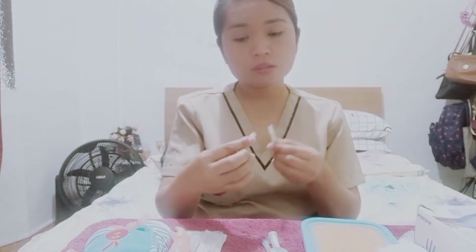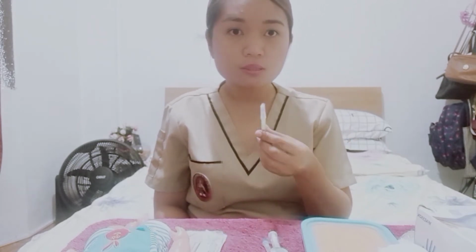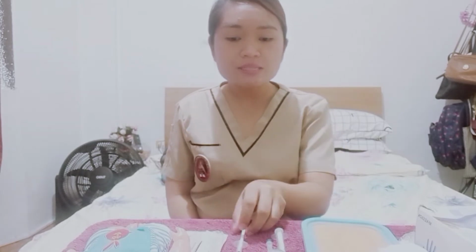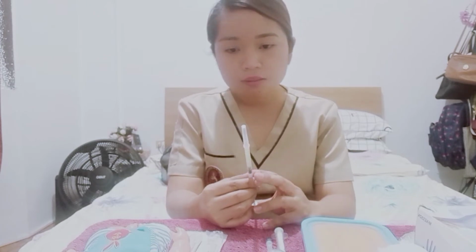So after that, we go ahead and change it before administration. So we are now ready to administer this to the patient. Now, for all injectable medications or vaccination, if we notice a large bubble on it, all we have to do is carefully expel the bubble, okay?